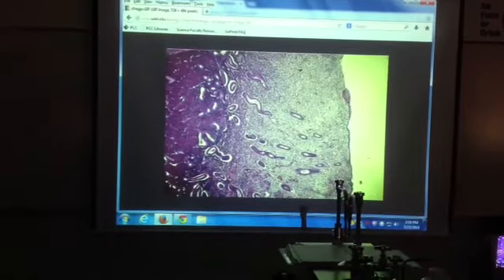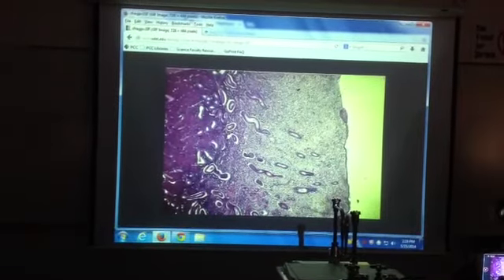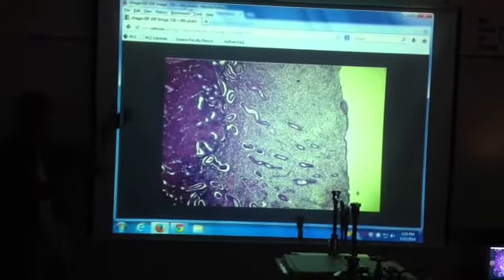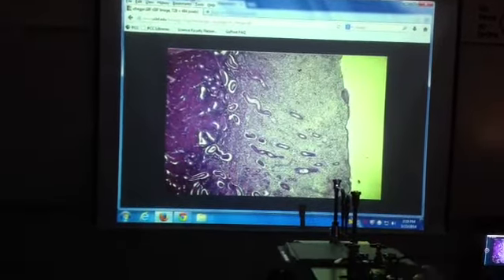So what I'm going to do, I'm going to randomly go through and find a few phases to scare you with. Let's try this one. Let's try this one. Okay, give me a phase. How many uterine glands do you see? Not that many. What shape are they? Kind of straight. Yeah, this one's crooked, but most seem kind of straight. Therefore, this is proliferative. There's very few glands. They're mostly straight and round. So, before ovulation.